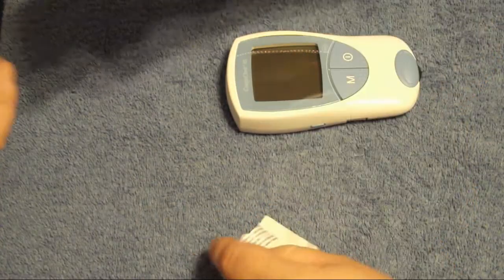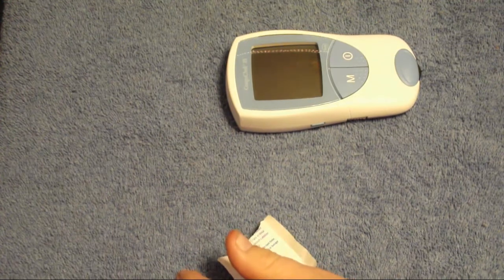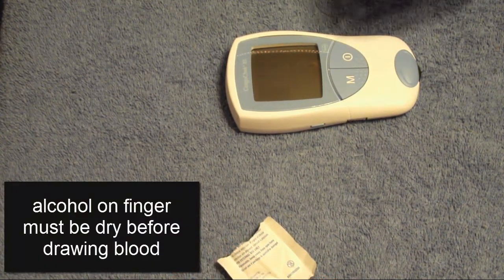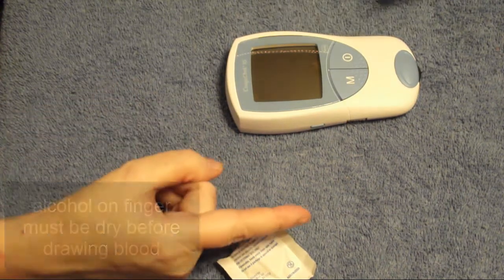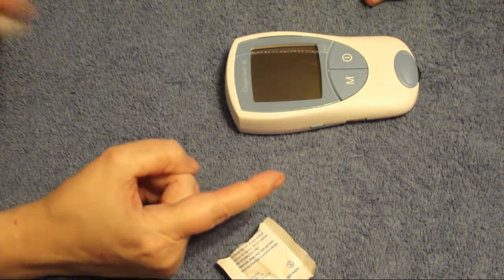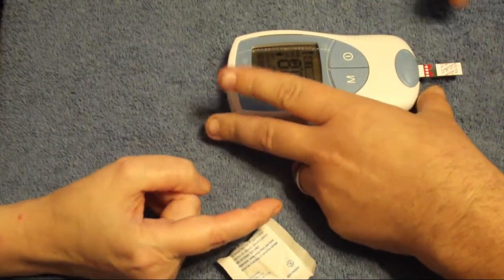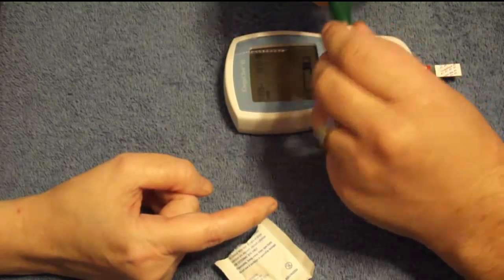First off, they tell you to use an alcohol wipe. Now you stick your test strip in — do not ever touch the little window here where the blood goes. If you touch it, it will mess it up.